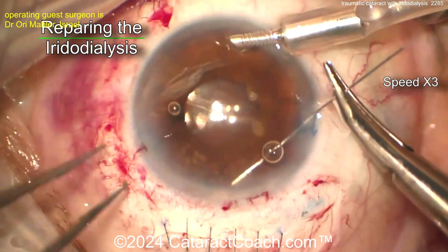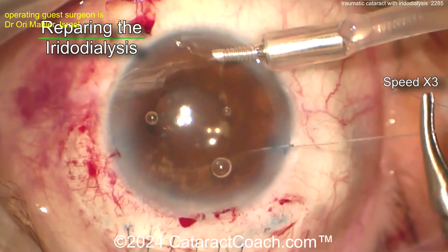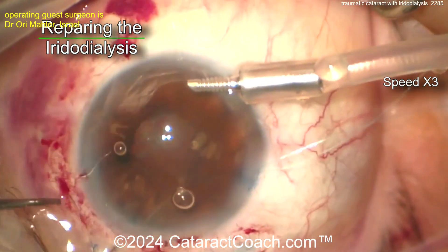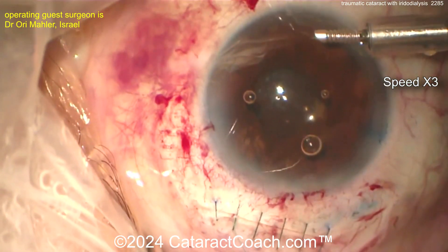Now time to fix that iridodialysis. Looks like a 10-0 polypropylene — yeah, probably 10-0 polypropylene — on a very long needle, and you're going to basically resuspend that iris. Bringing the needle out through the main incision — no, just poking out through the sclera somewhere, and then it'll be covered with conjunctiva.